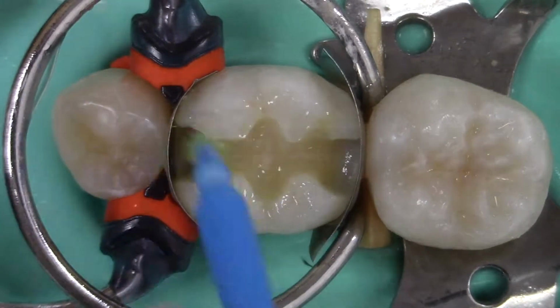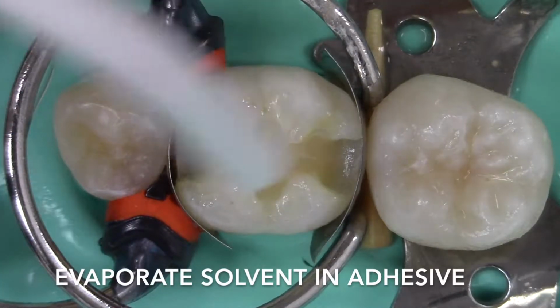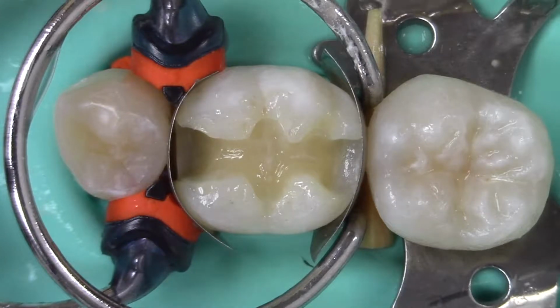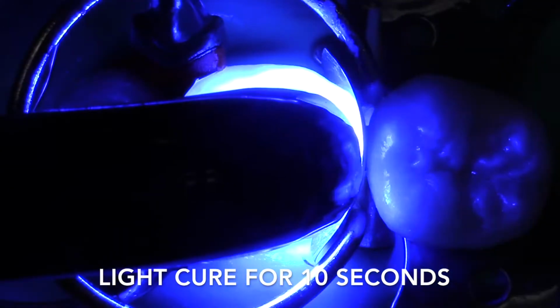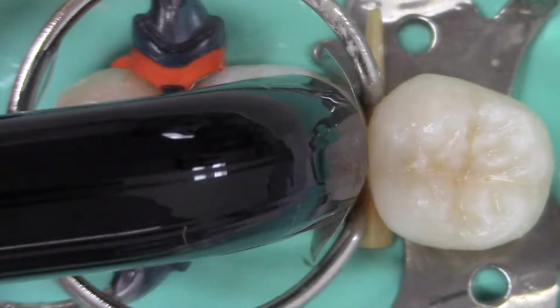After applying the adhesive, the solvent in the adhesive should be evaporated. A gentle stream of air should be applied on the adhesive until the adhesive stops moving and the surface appears like a thin film of saran wrap. The adhesive is then cured for 10 seconds, ensuring the light tip is placed parallel with the floor of the preparation and as close to the tooth as possible.